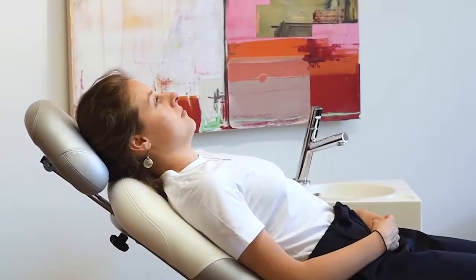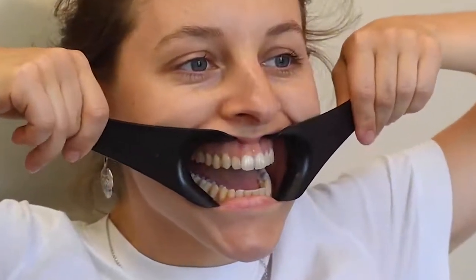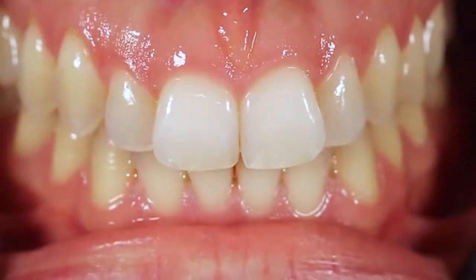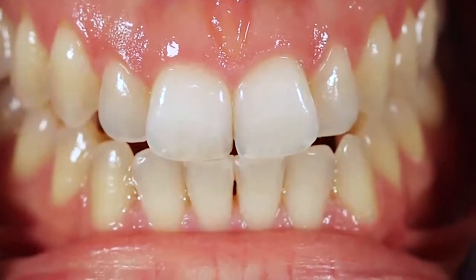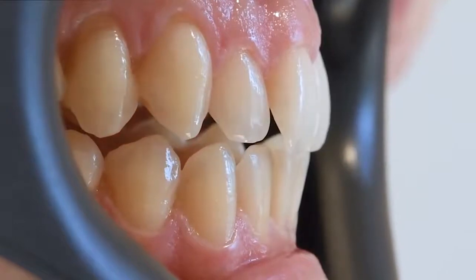We advise to always take your eLAB photos with the patient sitting in an upright position in front of you. It is always a good idea to use retractors, and when you do, advise your patient to pull them back and up towards the ears to fully retract the vestibule. Ask the patient to bite down and then to move the mandible forward into an edge-to-edge position and with the tongue removed from the back of the teeth.